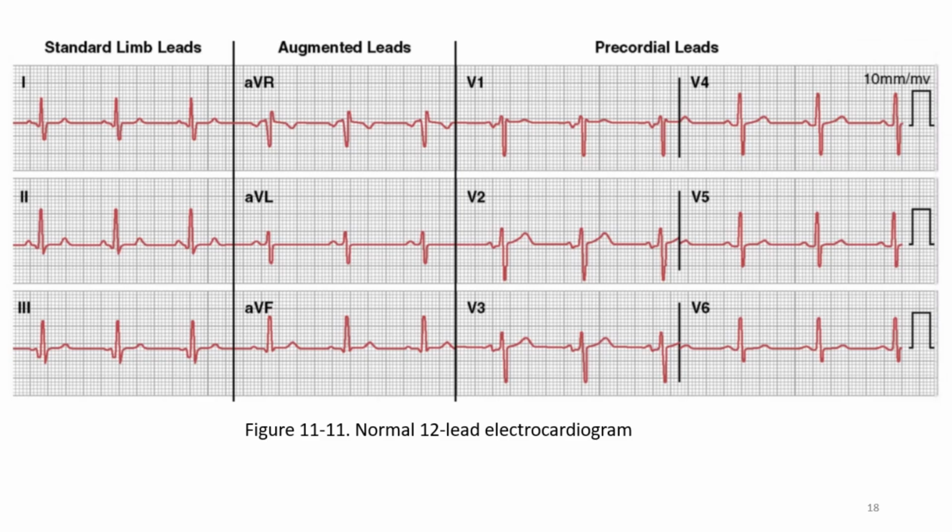We can calculate here how many times the heart beats, pulse rate I mean, okay, 1, 2, 3, 4, so 300 divided by 4, about 75 times per minute approximately in this case.